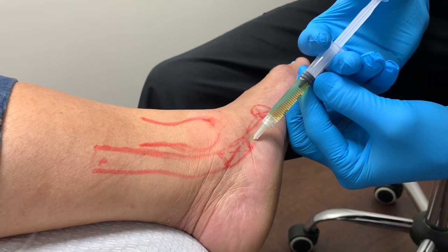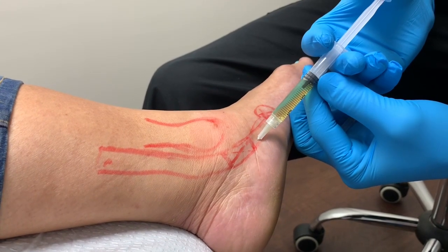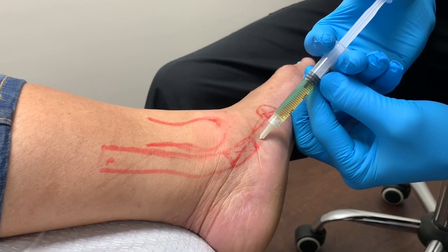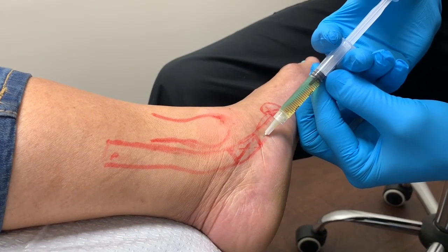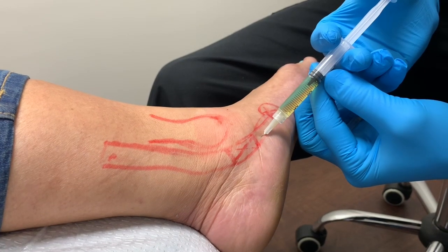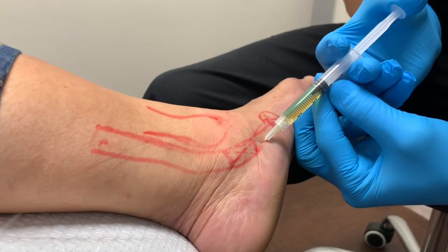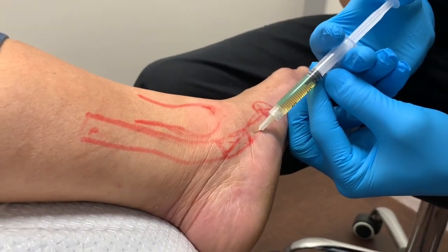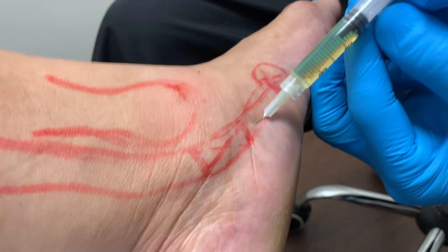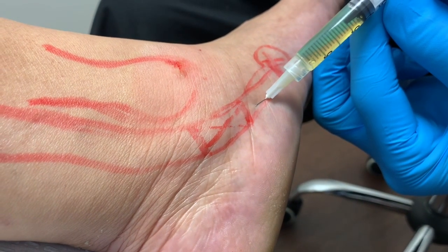It feels like a burning. But is it pain? No. No? Okay. How about now? I like to infiltrate very, very slow because I want to make sure that we maintain all the PRP, right, in the affected area.